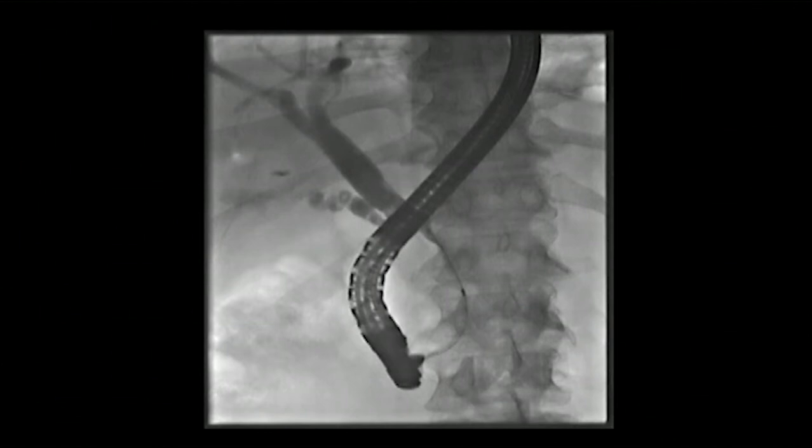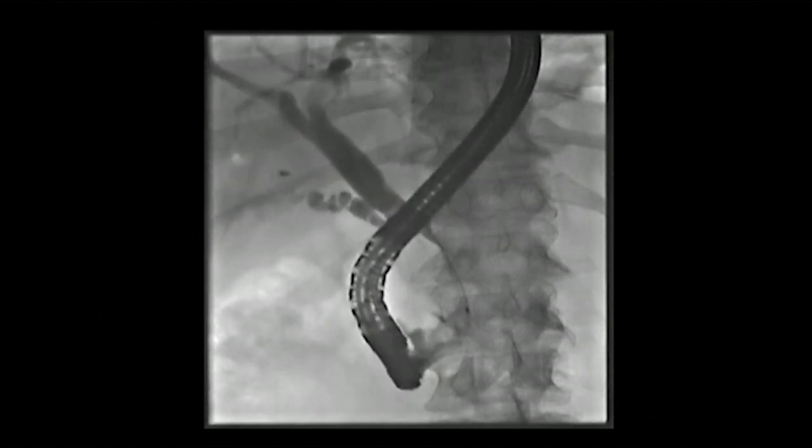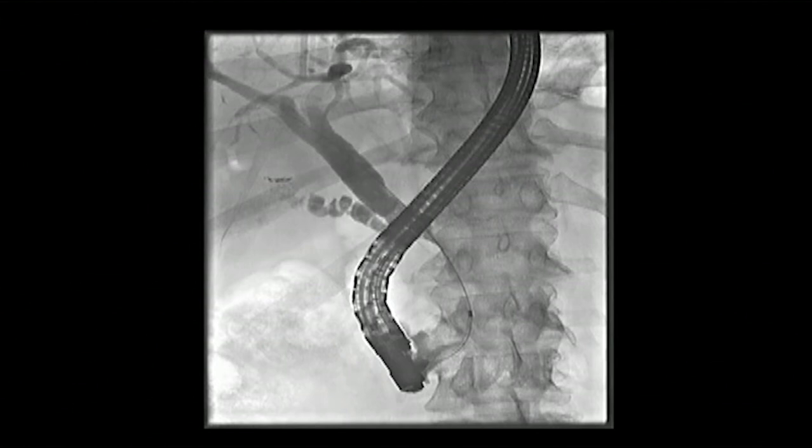We're slowly now withdrawing the catheter. Please give some more contrast. And you see there is a quite long distal stricture of a few centimeters. Stop. Picture, please. And there you see contrast flowing out into the duodenum. And you see this distal stricture really is at the location of the pancreatic head. Again, as I told you, the next step will be to do some more investigation with an intraductal ultrasound.